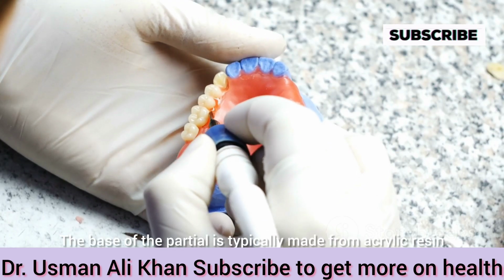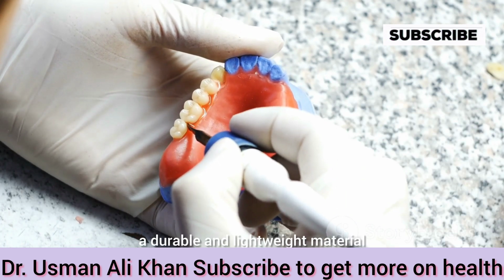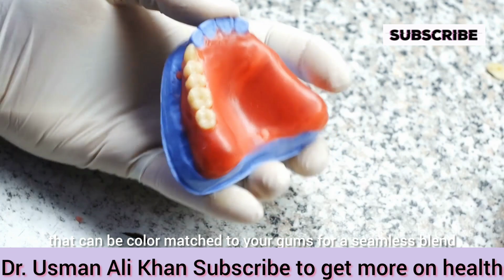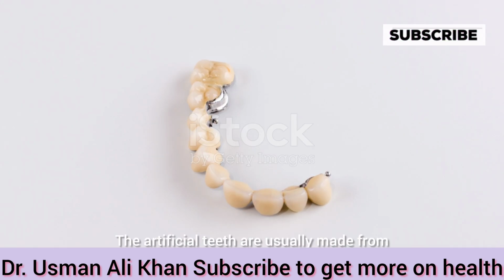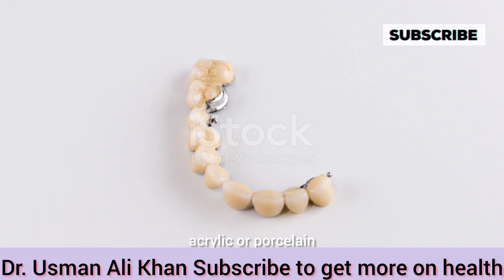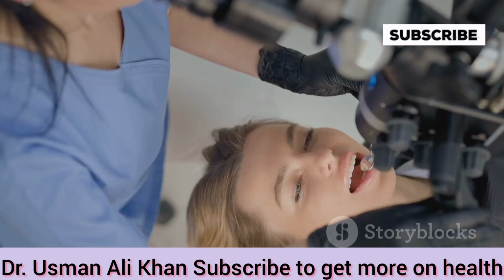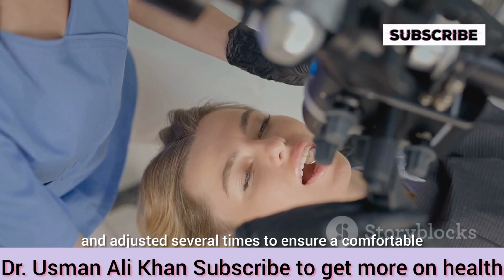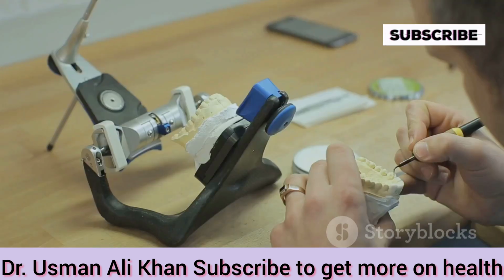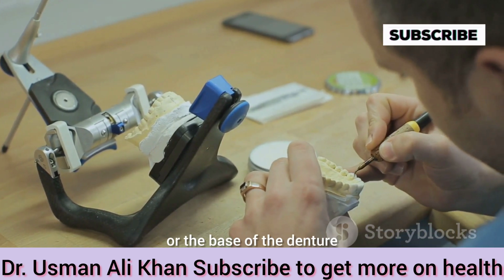The base of the partial is typically made from acrylic resin, a durable and lightweight material that can be color-matched to your gums for a seamless blend. The artificial teeth are usually made from acrylic or porcelain, chosen to match the shape and shade of your natural teeth. The denture will be fitted and adjusted several times to ensure a comfortable and secure fit. This may involve minor adjustments to the clasps or the base of the denture.